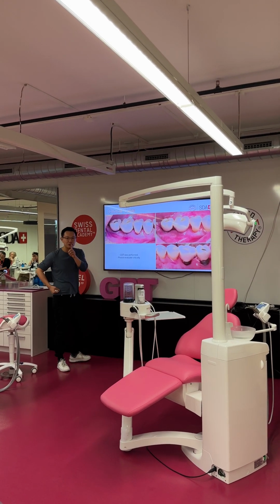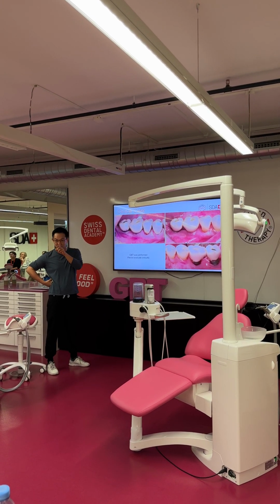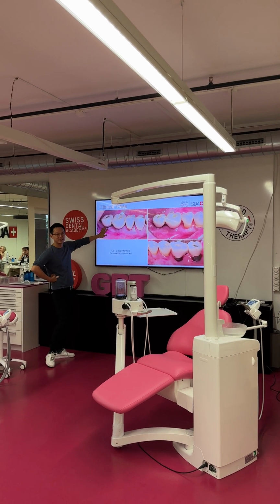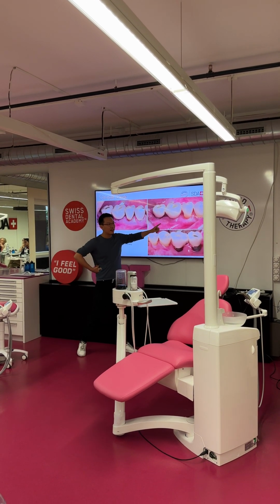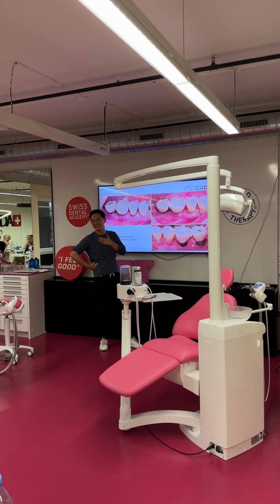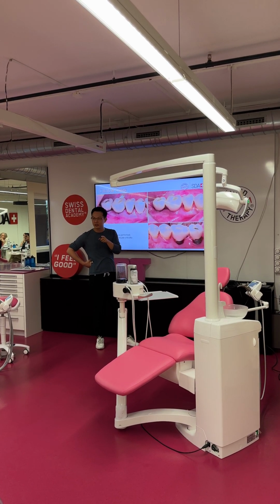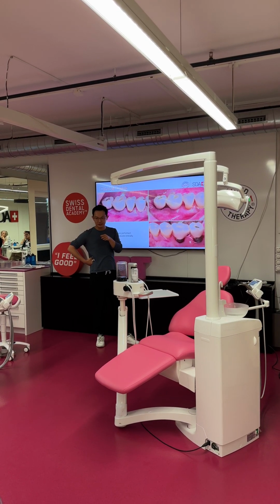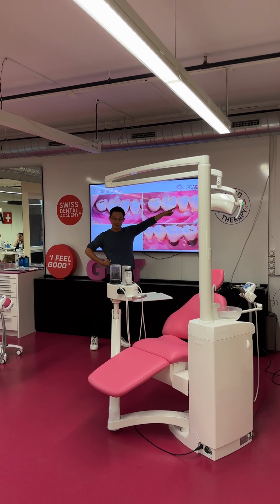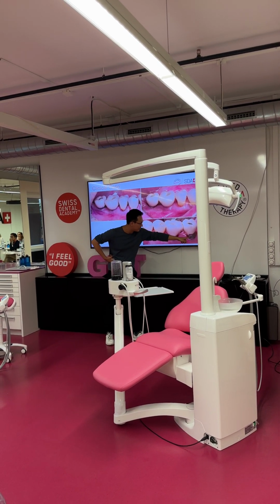But I want to show you that, me doing the GBT, I try my best, it's four-handed dentistry, but there's still a lot of missing spots for me. So this is, we just close, okay, and this is after. You can still see, especially, I take my photos and then my nurse sent me, should I show this? I want to show you just for educational purpose. The challenging part is the distal buccal, distal palatal, distal lingual aspects. See here, I didn't clean them. And that's post. And also lingual, it's very difficult to clean in these groups.